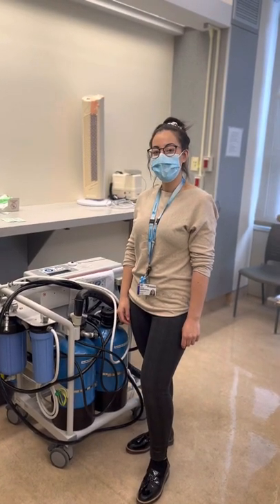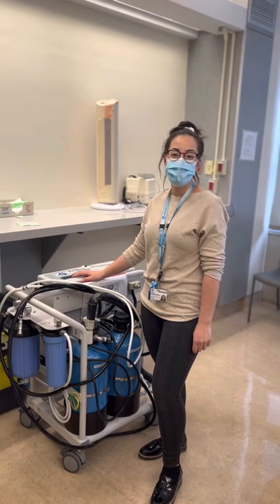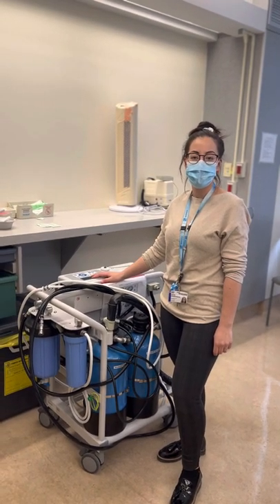Welcome back to our YouTube channel. Today we're going to be reviewing connecting the Aqua C1 and the dialysis machine in the emergency setting for an acute dialysis treatment.